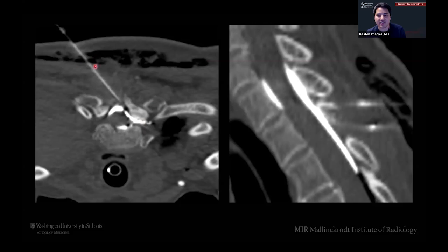And then up here in the skin, right, you never want to get your ice ball coming up to the skin. That's going to cause some necrosis, wound healing issues, and be very morbid afterwards. So displace that skin if you can with CO2. Again, a gas is going to be a better insulator than a liquid. So CO2 is ideal, but if you can't, right, sometimes gas goes wherever it wants to go, then you just put some liquid in there instead and push things away.